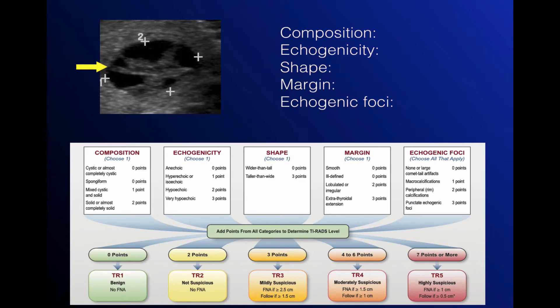This nodule here is not solid — it's mixed cystic and solid, so it receives 1 point for composition. Echogenicity is determined from the solid component and it is isoechoic, so 1 point. For shape, margin, and echogenic foci it receives zero points, making this a 2-point nodule: a TIRADS 2. This does not get FNA or follow-up regardless of size.